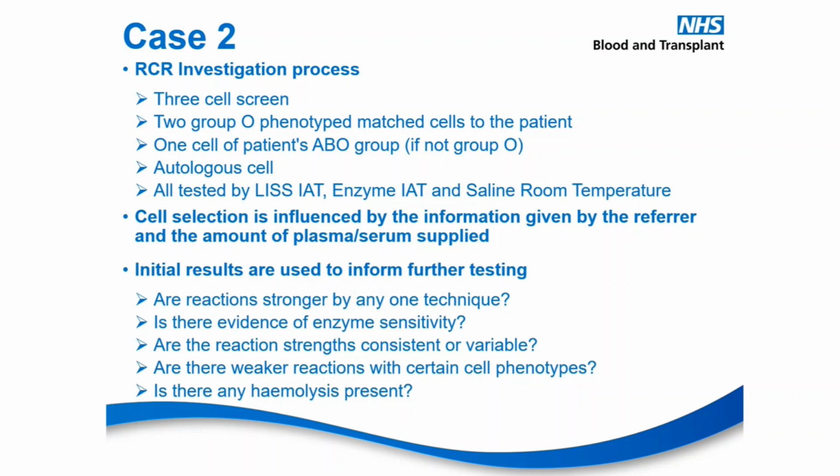So they're looking for things like, are reactions stronger by any one technique? Is the antibody enzyme enhanced? Is it temperature enhanced? Is there evidence of enzyme sensitivity? Are the reaction strengths consistent or variable? Are there weaker reactions with certain cell types? Or is there any hemolysis present?